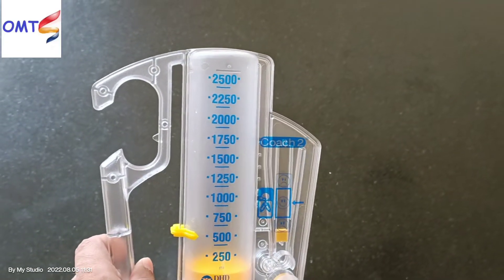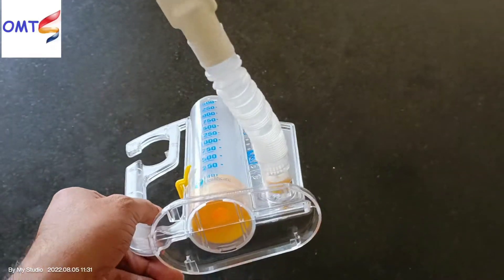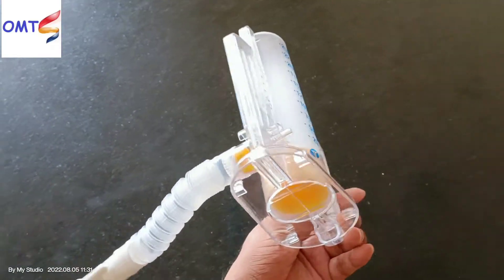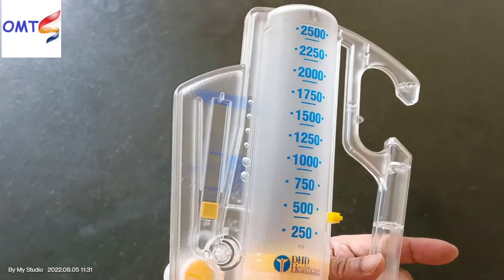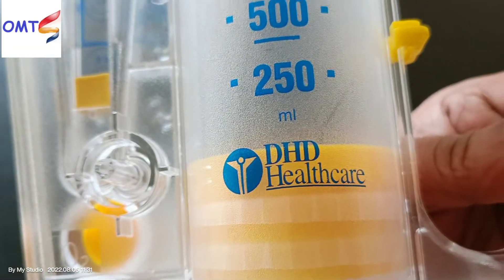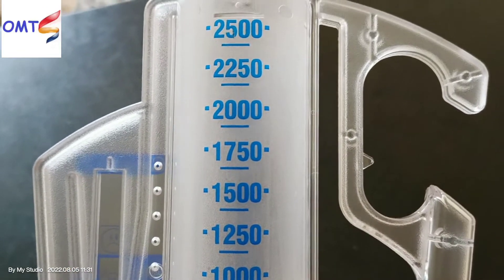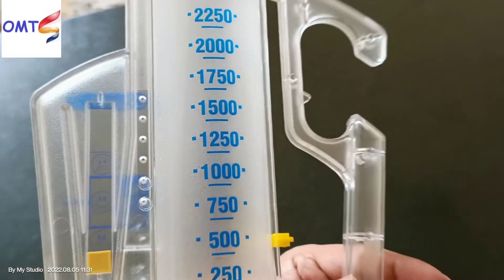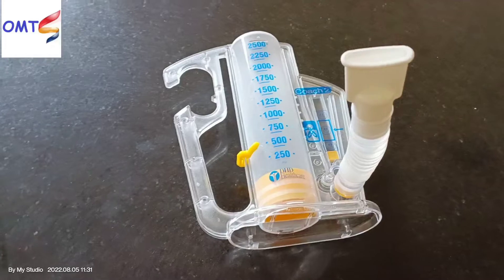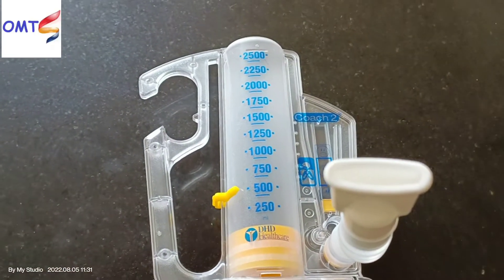Our breathing process — the same as how we keep our oxygen — these things become much weaker, and then we use this machine. We use this machine to improve the energy and breathing quality of patients. We can use this machine for lung exercise.